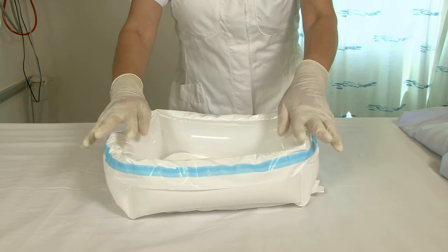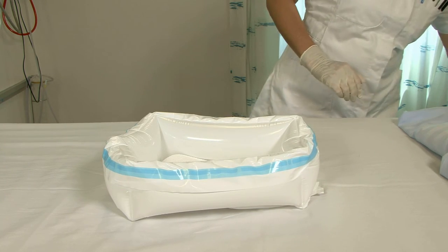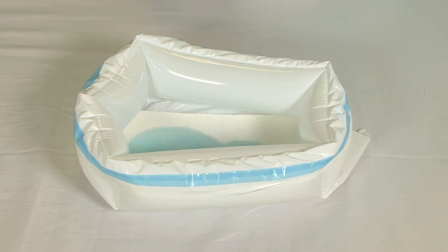Place the patient on their side and roll him or her onto the bedpan. The bedpan is designed to withstand this pressure and it moulds itself to the patient's body.